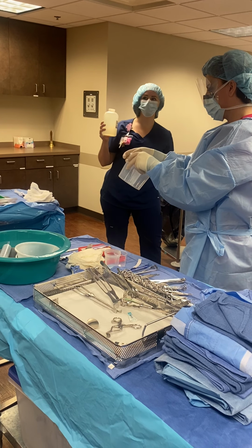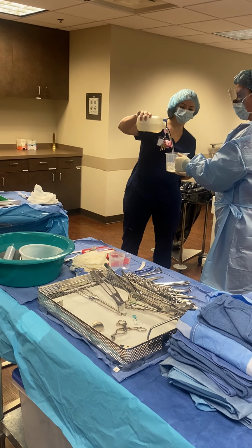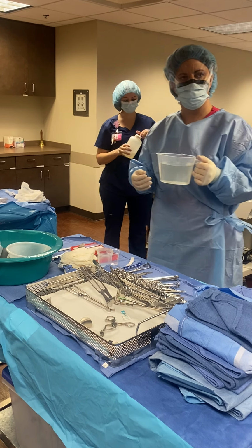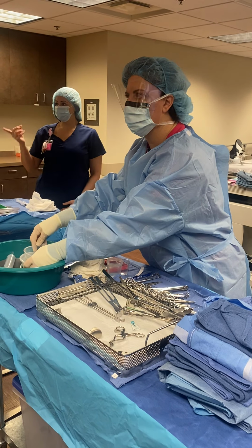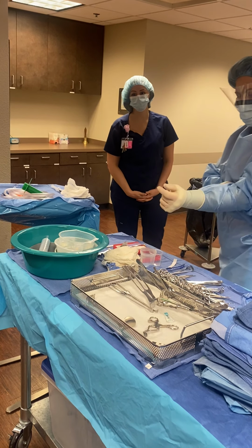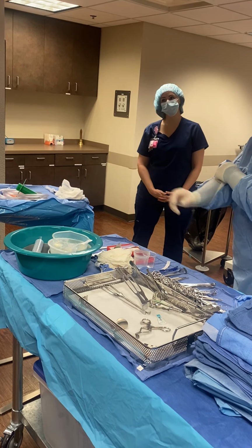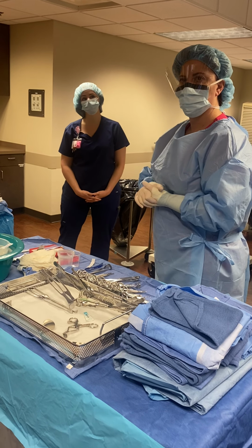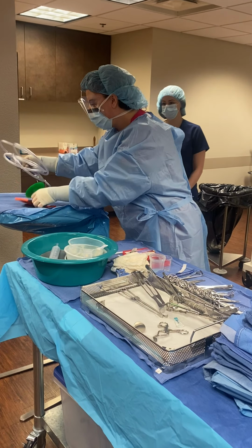Think about what we're removing. What are we potentially removing? Tissue, so you don't want to compromise the tissue. Tissue that could potentially be what? We're doing a breast biopsy. What are we checking for? Tumors, cancers. And what could the tumor be? Neoplasms. Cancer, right? So why would we choose to use sterile water if we think there's cancer? What do we know about isotonic, hypertonic, and hypotonic solutions and how cells react to those? That's your homework.